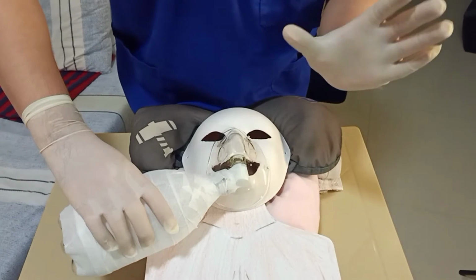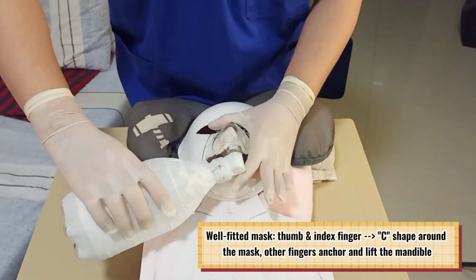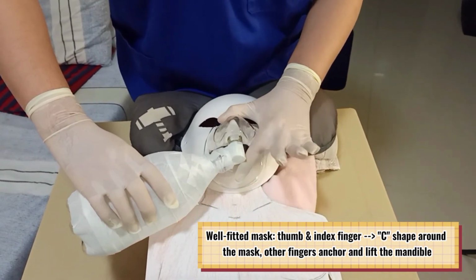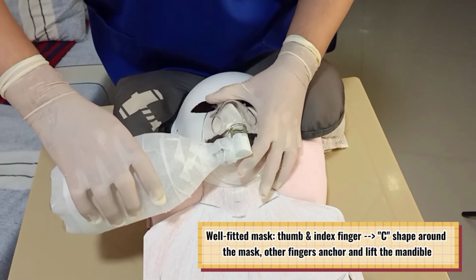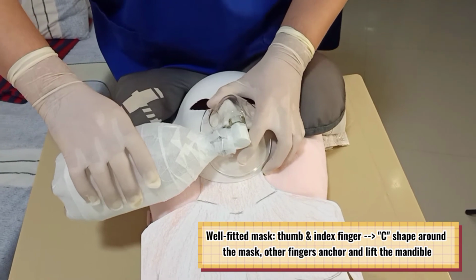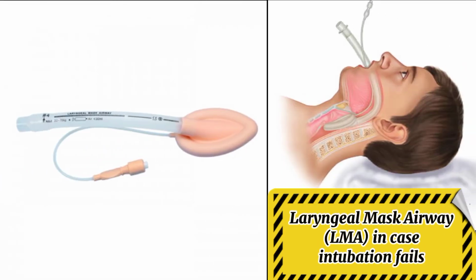The thumb and index finger should make a letter C shape around the mask, holding it above and below the connector respectively, while exerting downward pressure, while the other fingers make a letter E on the jaw with the 5th digit on the mandibular angle to provide upward displacement or lift of the mandible. Prepare a laryngeal mask airway as backup in case the intubation fails.